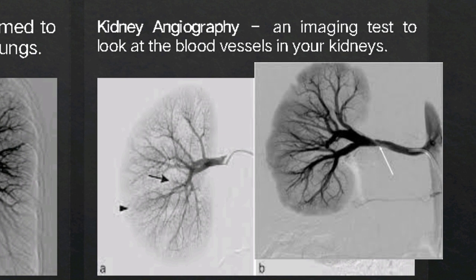During a kidney angiogram, the guide wire and catheter are inserted into the femoral artery in the groin area and advance through the abdominal aorta, the main artery in the abdomen, and into the renal arteries. The procedure will take approximately 1 hour.